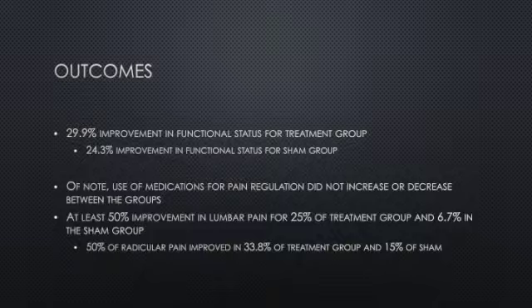to a functional improvement. I think a special note is that medication use within this patient population didn't actually decrease, and that's pretty concerning for the efficacy of the use of TENS when our goal is to decrease pain so that we don't have to use things such as medication or pain blockers.